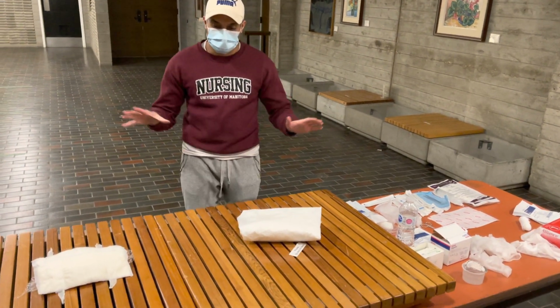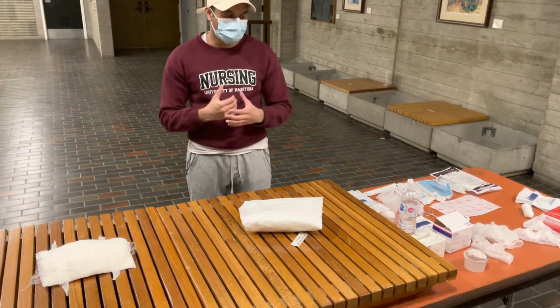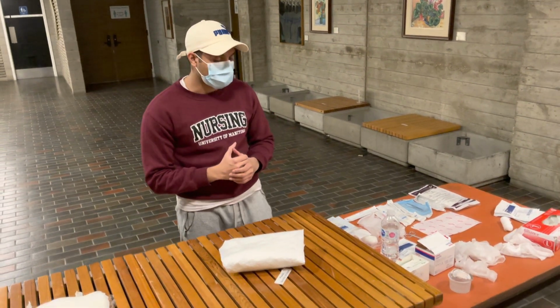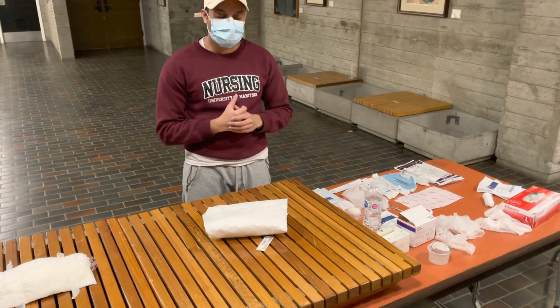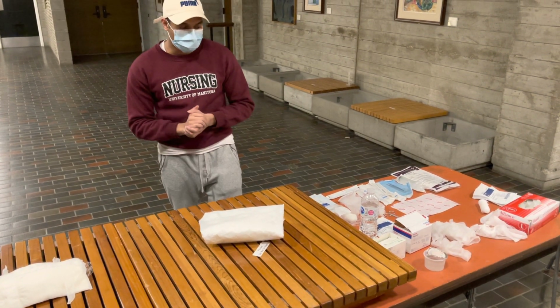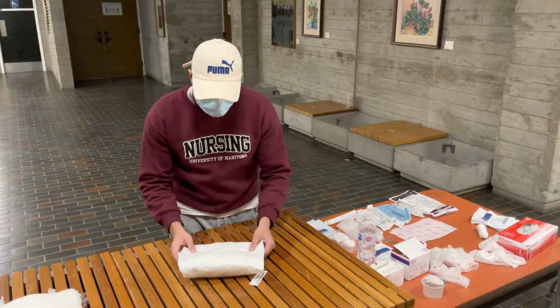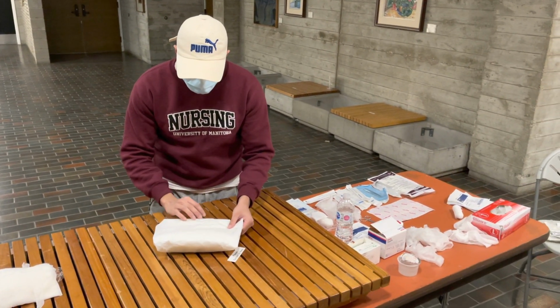Okay, before I start, I'm just going to make sure the bed is at the proper height at our waist level, so we're maintaining sterility, and make sure that the table we're working on is also at waist height. And we're going to make sure to close the blinds to maintain patient privacy. So we're going to do that. Now we've done that, so we're just going to wash our hands, and we're going to get our sterile tray ready. Okay, so we're doing it right now.